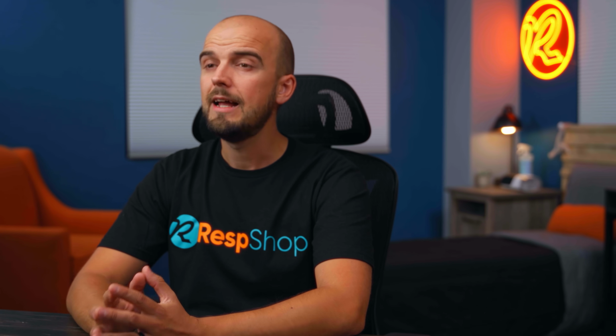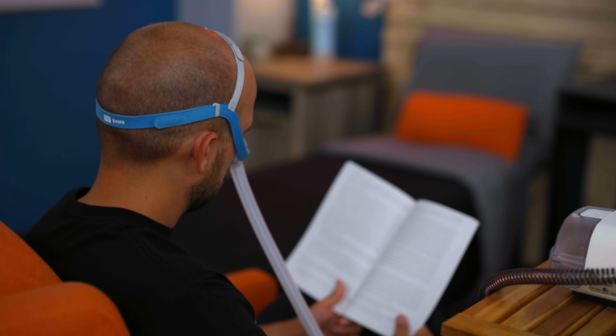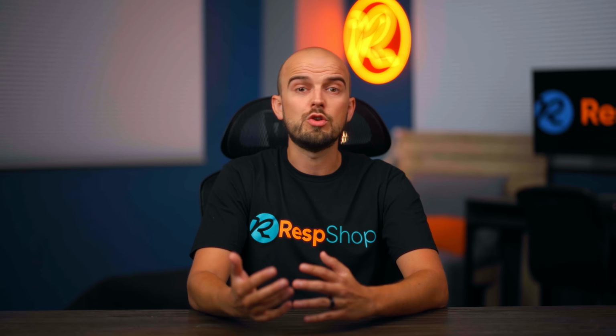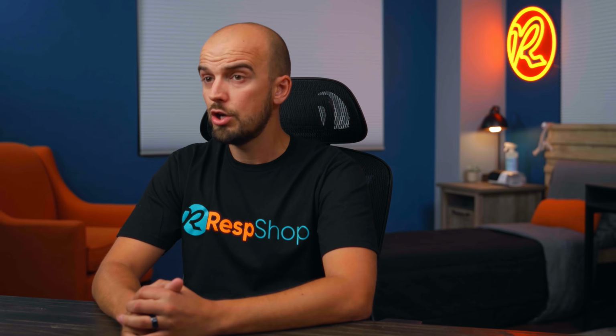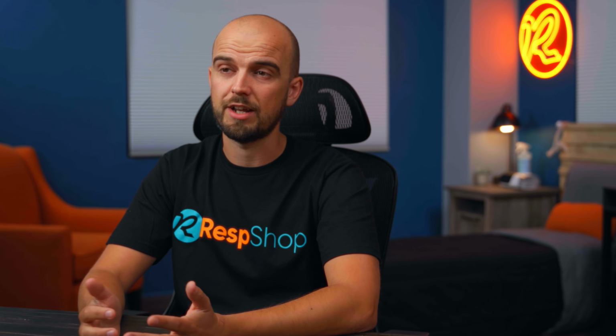If that's you, it's good advice to wear your mask while you're awake and doing other things to get you used to wearing it. Maybe try wearing it while you read something or you're watching TV for half an hour. The idea here is to get your body used to being in a calm state while you're wearing it so that you associate the mask with pleasant and calm situations, and the association carries over to when you need to sleep. You can either do this practicing with the pressure off or while the CPAP is running, whichever you find most appropriate.